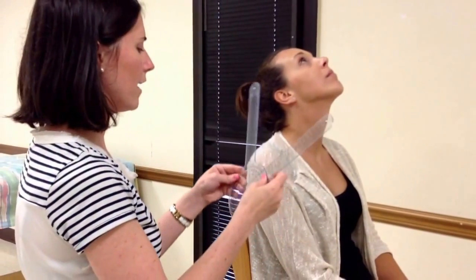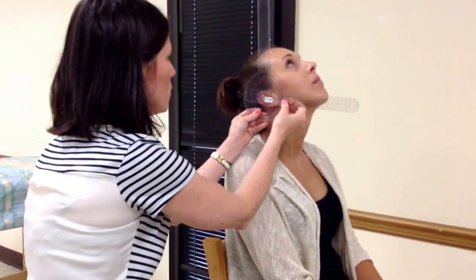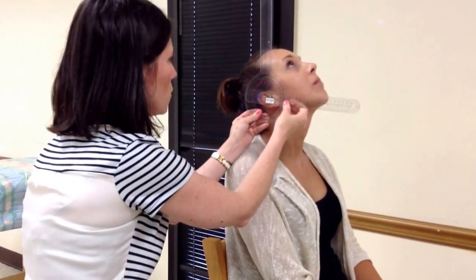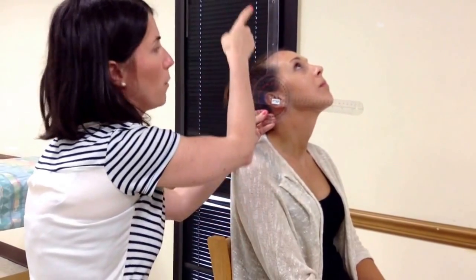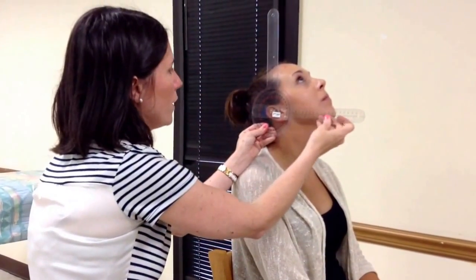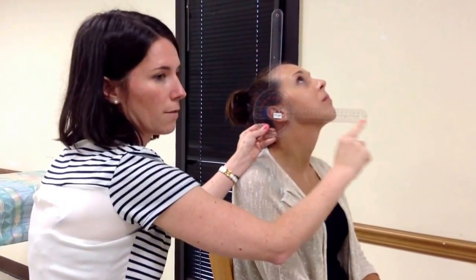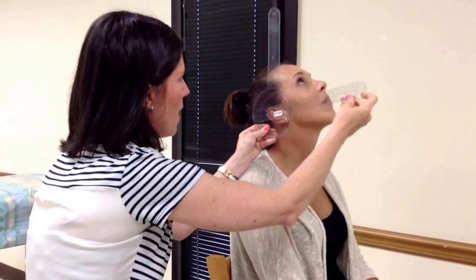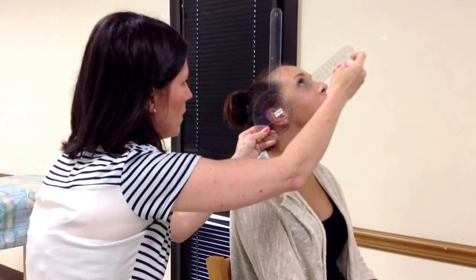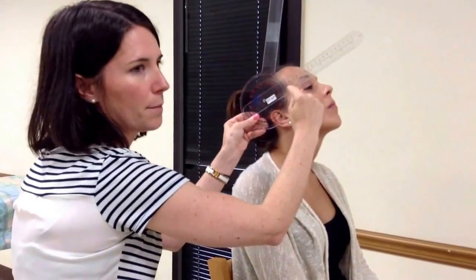All of my alignments stay exactly the same. The fulcrum goes over the external auditory meatus, the stationary arm is perpendicular to the ground, and the moving arm started at 90 where the base of her nares were originally. Then I move them up so that they're in line with the base of the nares, and I read this number here. That's it.